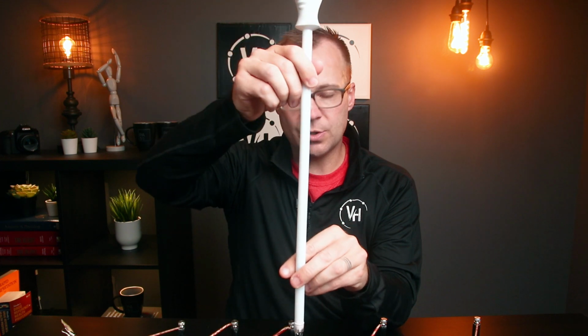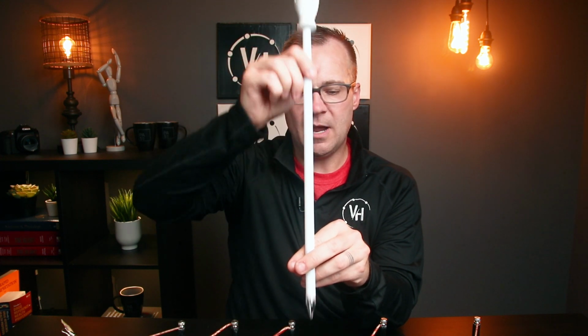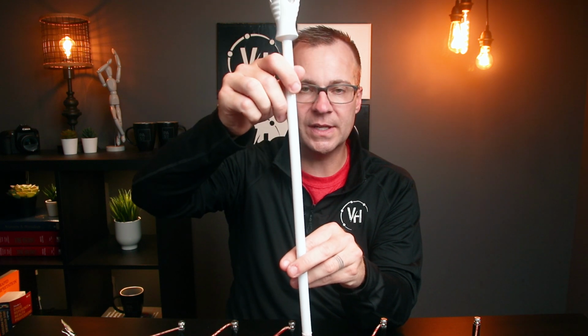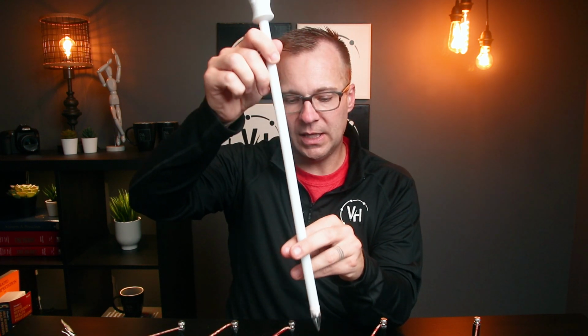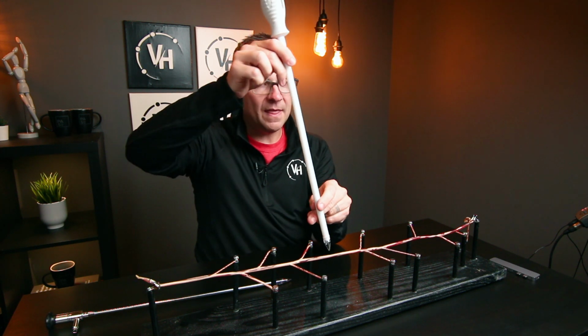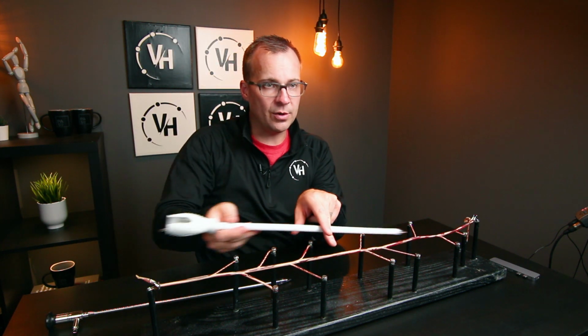We want to insert our scope like this, and we want to kind of pop up and down until we encounter that saphenous. Once we have seen the saphenous, we can pop some holes above and below, just through the connective tissue to kind of make that pocket. And then we're going to drop our scope down and start our dissection.